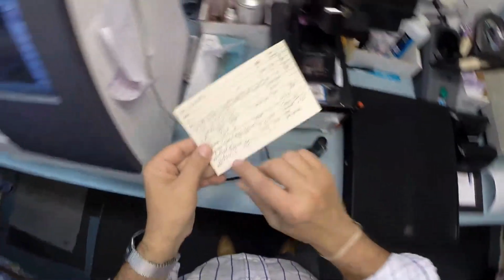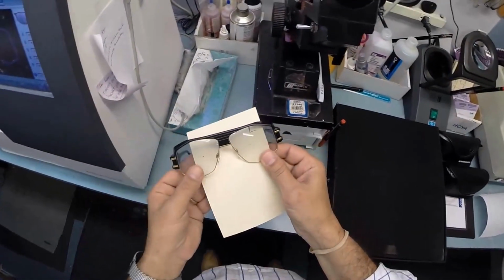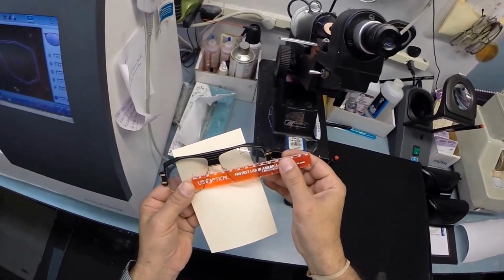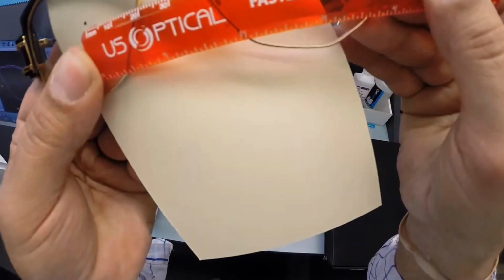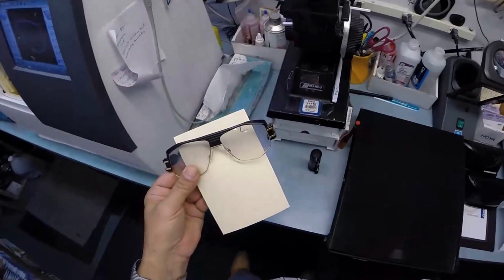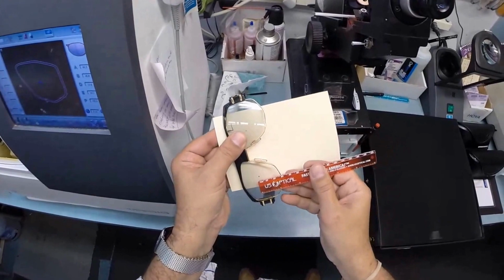Now your pupillary distance, 29.5 in your right eye, 30 in the left, for a combined value of 59.5. I'm going to place my PD stick against my thumb on your right lens. And then when we hold it up to the left lens, you'll see that it's 59.5, exactly halfway between 59 and 60. Let me check that optical center in there. Look at that. The kid is good.